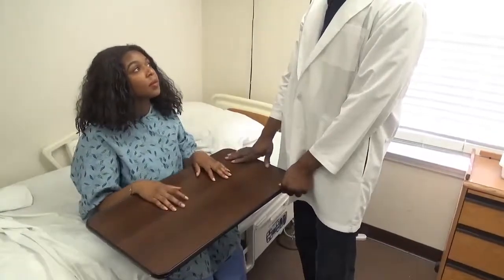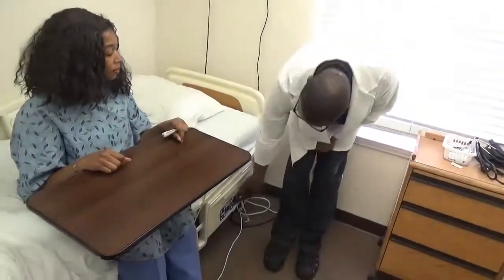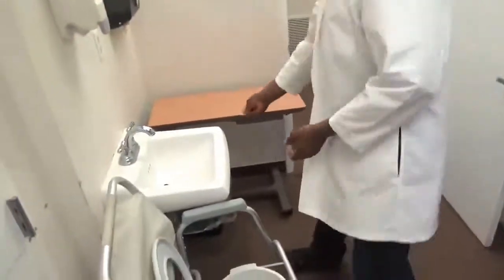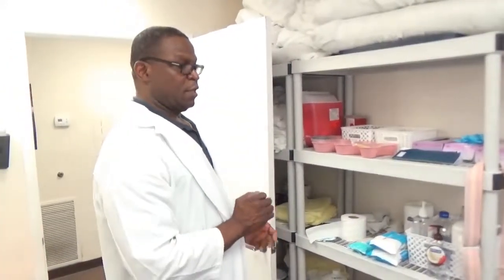Would you like to sit or would you like to lie down? Sit. Sit, okay. Give your resident a light. Thank you. Make sure the bed is in the lowest position and the bed is locked. And then you're going to wash your hands first. Wash your hands. The examiner would have given you a sheet to record your result. Then you will record 110 over 56. You have to come to within 8 plus or minus of the examiner's result to be able to pass. That concludes blood pressure.